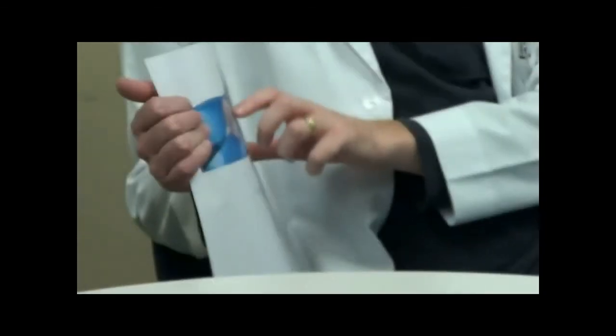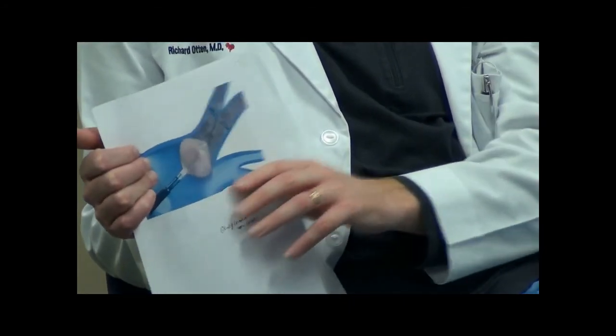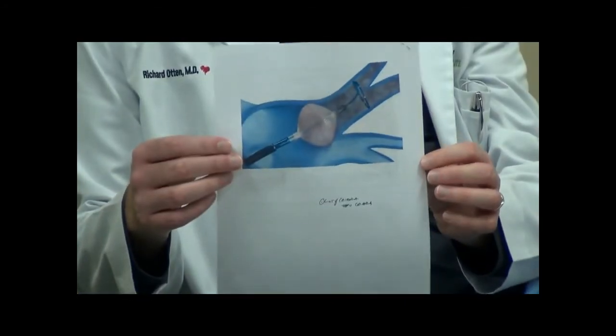No, so the cryoablation is this balloon. There's a picture on the back. We put in this lasso catheter, and then you occlude the vein and you freeze the opening. That's how we're doing this cryo right now. Versus the previous page, page 3, shows you what we do with an RF ablation. We have 2 separate catheters. One looks like a lasso, and then you have the straight catheter, which is the burning.